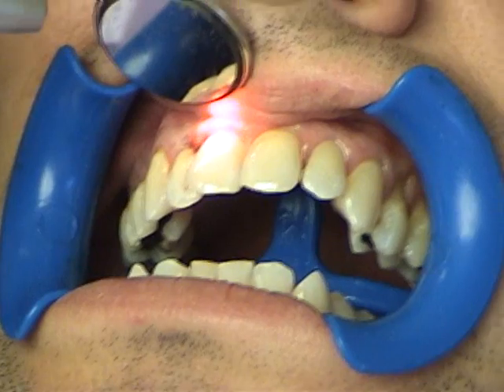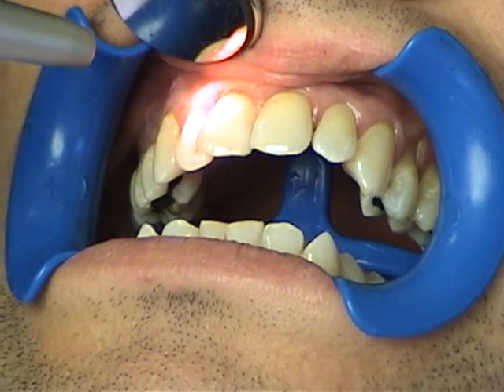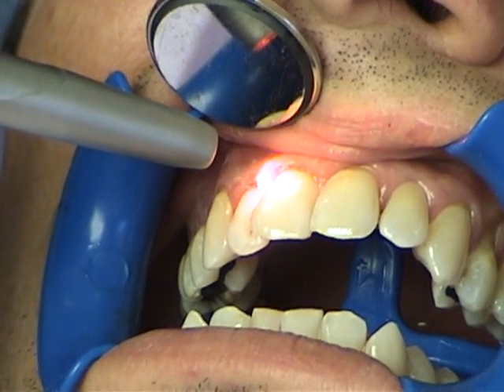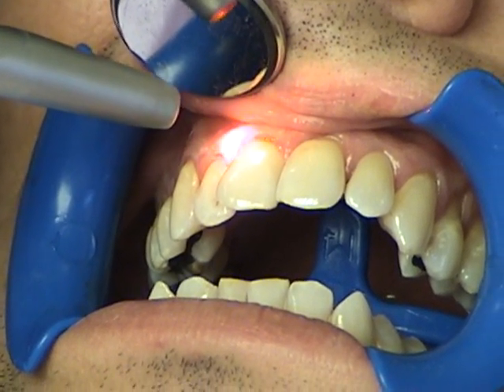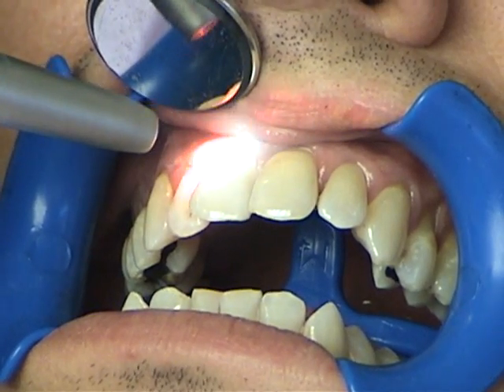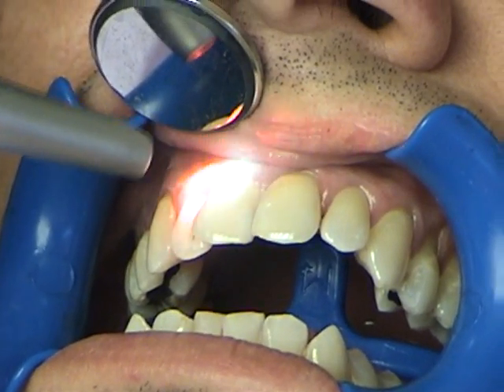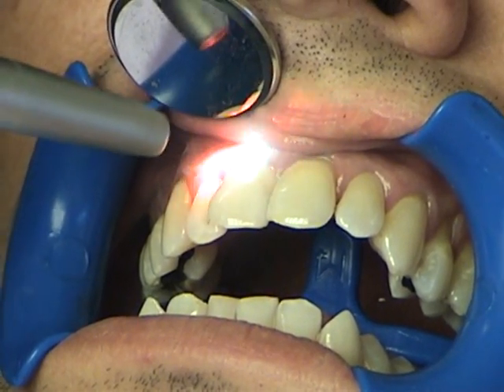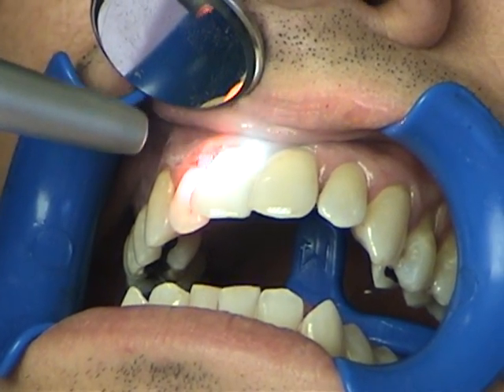We're going to do one last thing: a little biostimulation in the area. I've taken the tip off the end of the handpiece and I'm going to shine the laser light on this area for 30 seconds — one watt continuous wave — just for a little biostimulation to promote healing. And that should do it.